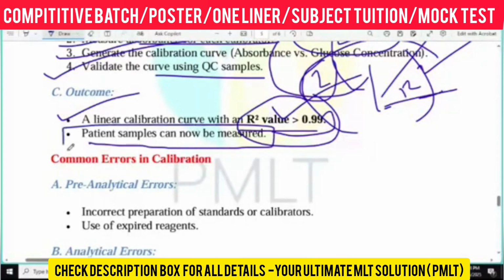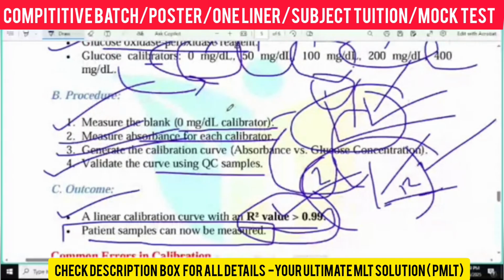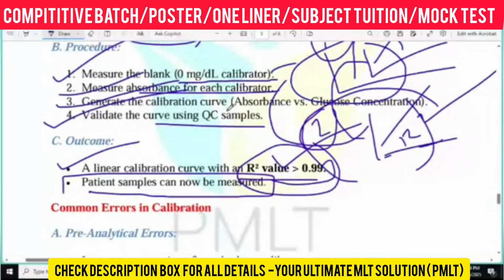Firstly you choose the calibrator. It's very easy. After that you measure and use the calibrators one by one. After that the graph will appear. If the R square value is higher than 0.99, then we can use the machine and we can measure the patient sample. Getting my point? Understood everyone? Yes, sir. Okay, anyone have any doubt?